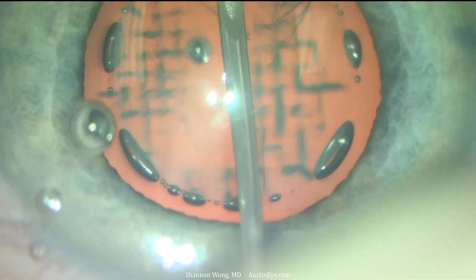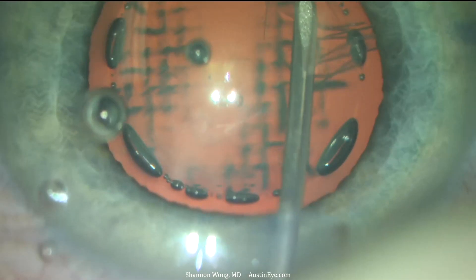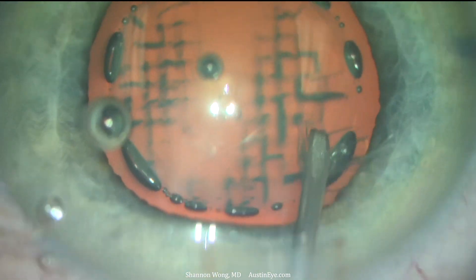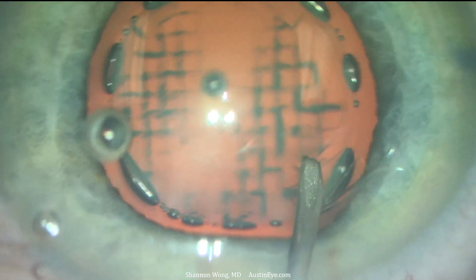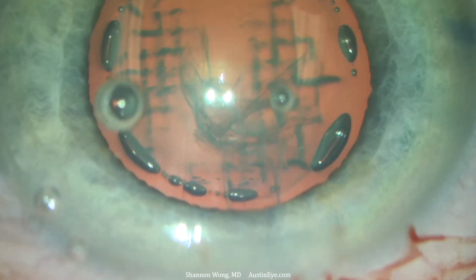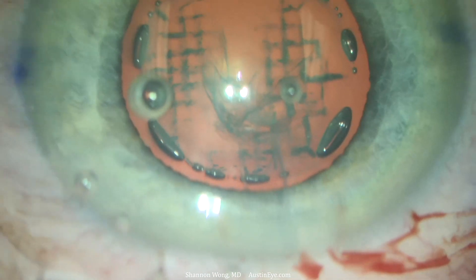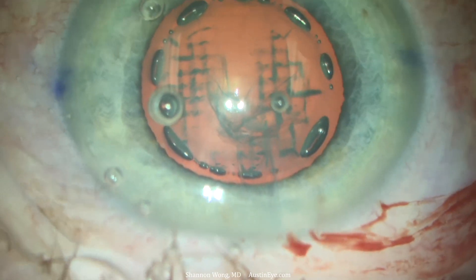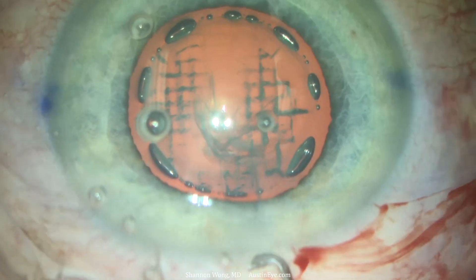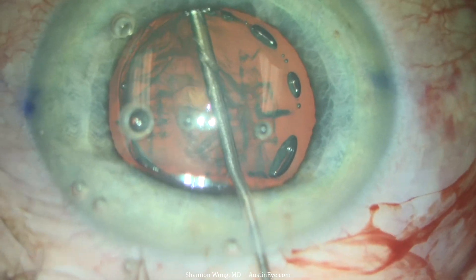It is easy to fall prey to thinking that this capsulotomy is simply incomplete and that the surgeon can simply separate any anterior capsule tags. If you see this pattern, it represents either a partial capsulotomy that is incomplete or no capsulotomy at all.